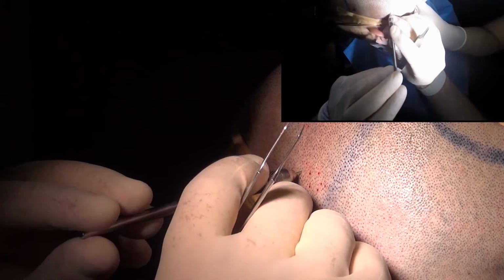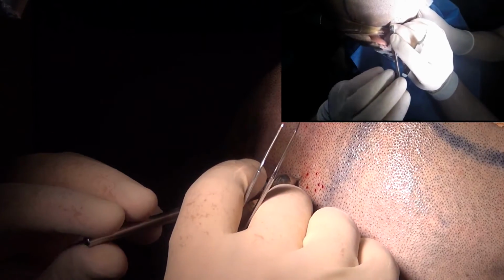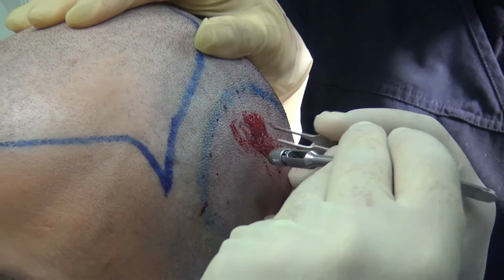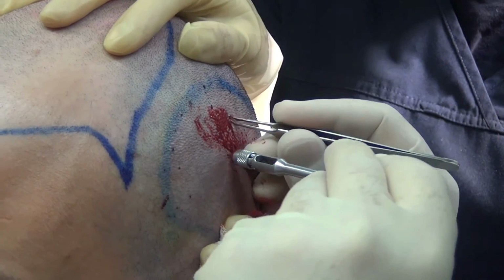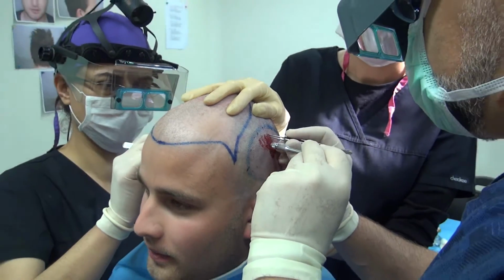In the synchronized video, it is evident that the follicles are sometimes at different angles. The sitting position enables the physician to adapt and better pinpoint the graft more quickly. In a sitting position, the physician can access long-hair donor photos during the extraction to effectuate a better harvesting plan, while another physician can simultaneously perform extraction on the opposite side.